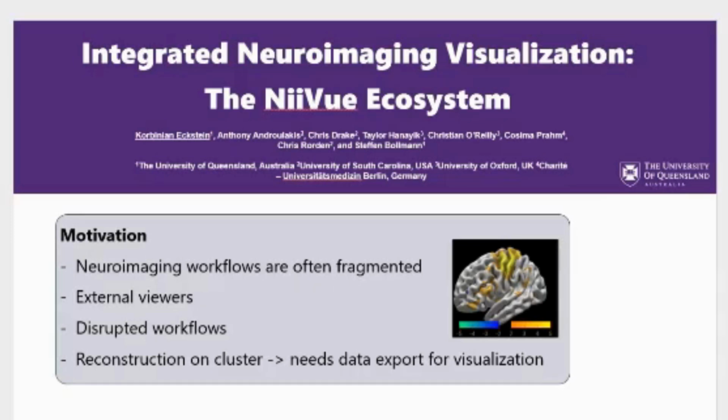So my post is about integrated neuroimaging visualization, the NiiVue ecosystem. Our motivation was that neuroimaging workflows are often fragmented. In your neuroimaging workflow, you do some data processing, and then you need an external viewer to view the results and intermediate steps, and that disrupts certain workflows.